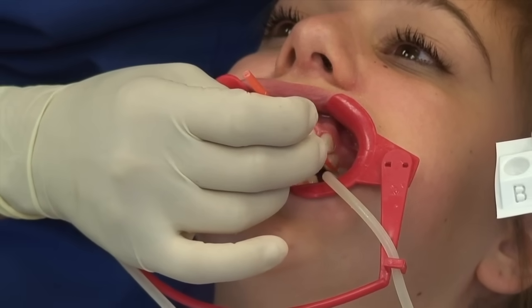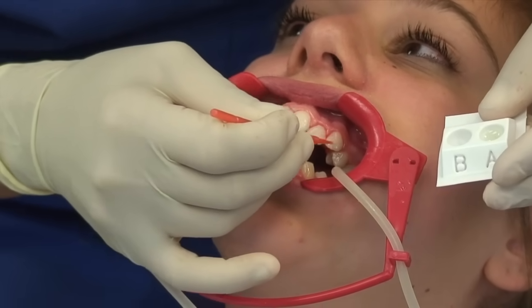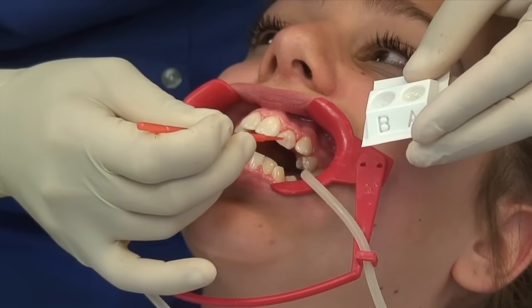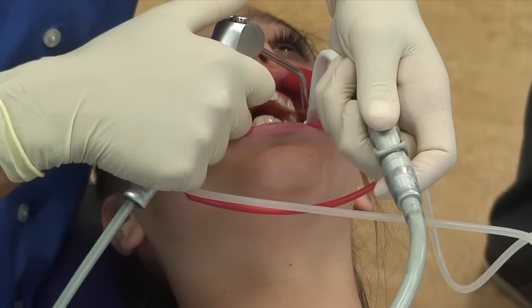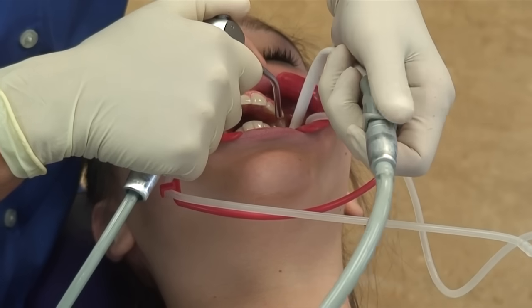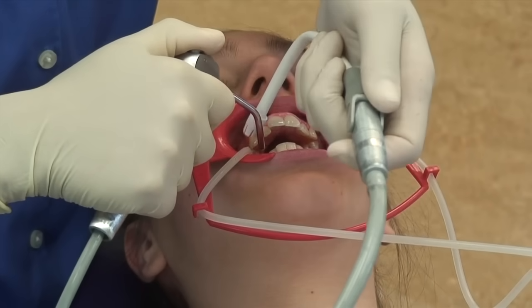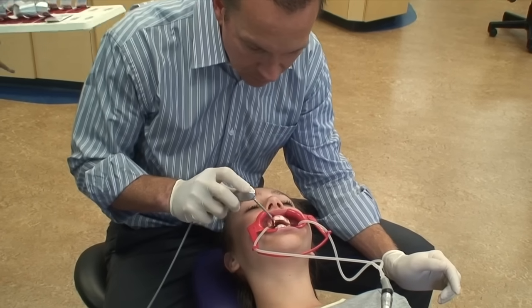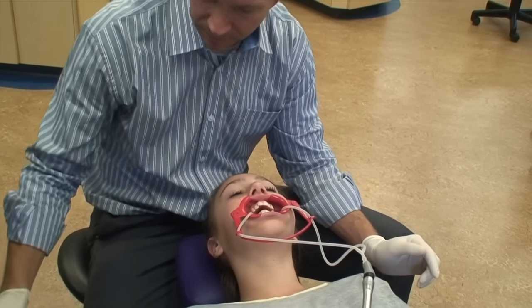And here you see that we're painting each individual tooth with a little cotton applicator, and we're basically sterilizing the tooth surface and preparing it for the glue. This glue is a special kind of glue that sticks to tooth surfaces only after they've been prepared with this special material. Once we put the sterilization agent on, we rinse it, and then we dry it off. We want the teeth to be as dry as possible.